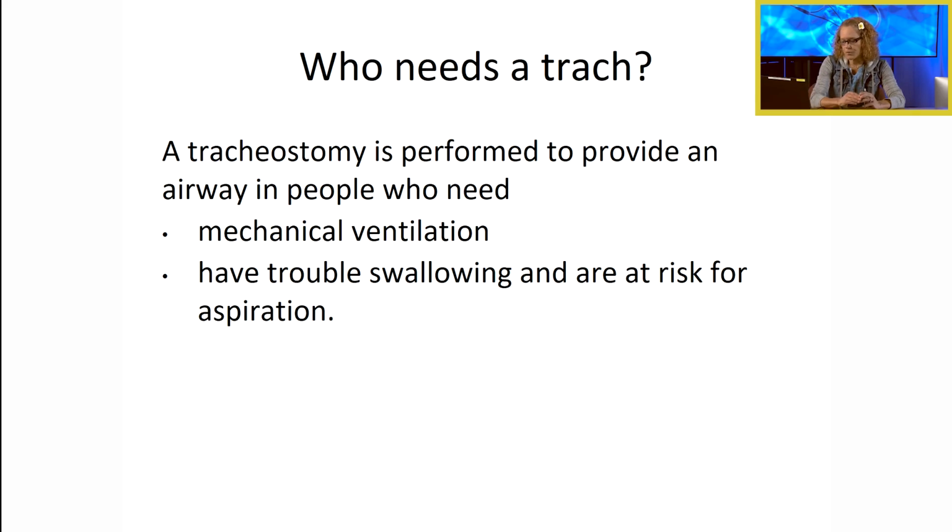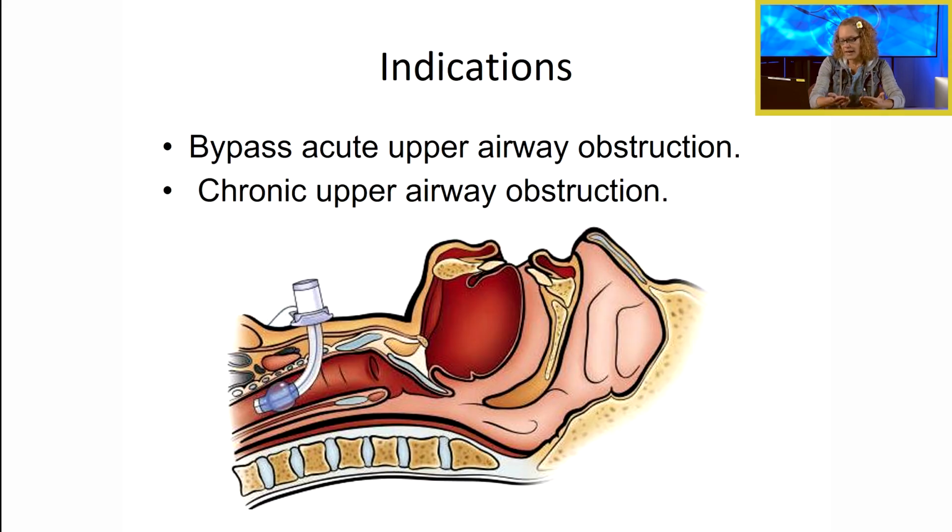This is performed to provide an airway in people who need mechanical ventilation, people who are having trouble swallowing or may be at risk for aspiration. We use a trach tube to bypass an acute upper airway obstruction or a chronic upper airway obstruction.